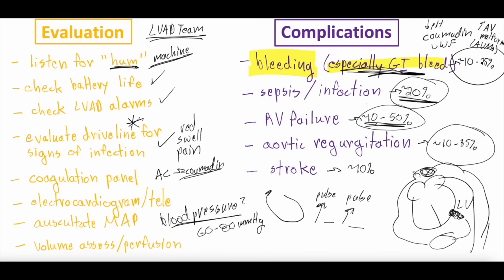So it's implanted here in the aorta. But if you have aortic regurgitation, and you're shooting all this blood into the aorta, that's a lot of pressure in the aorta. And if the aortic valve regurgitates the wrong way into the left ventricle, a lot of this blood will end up going back into the left ventricle. Much less of that blood will go forward, and that'll make all of this worse. So it can really affect patients. You should always consider aortic regurgitation, because many patients develop it over time.